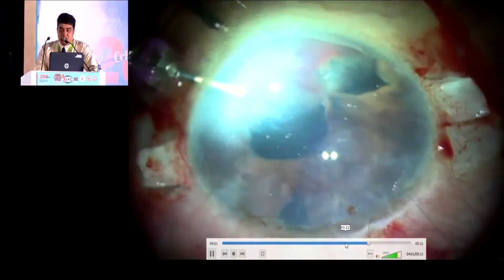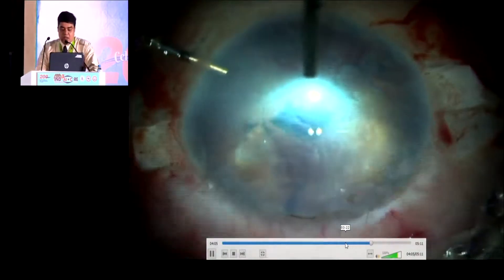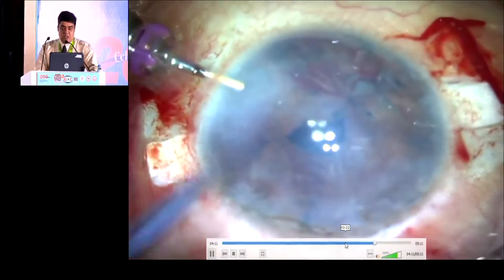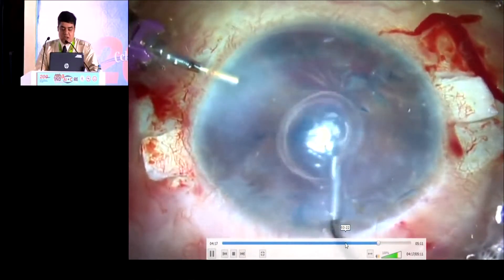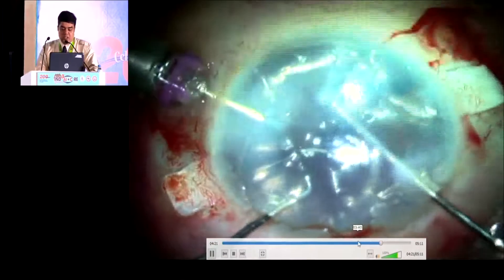Once the iris repair is done, we will see whether any other vitreous strands are there by injecting an air bubble, and we see there are no vitreous strands. With the help of a blunt instrument, we are going to check if any remaining strands are there, and gently remove them.